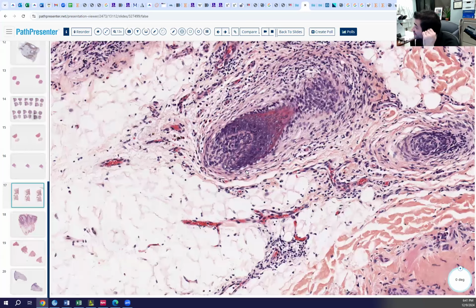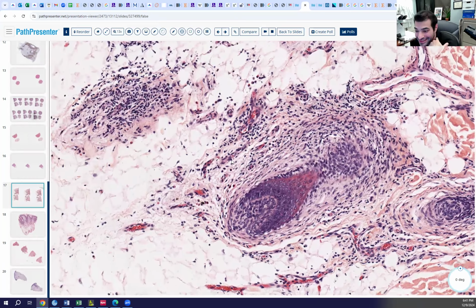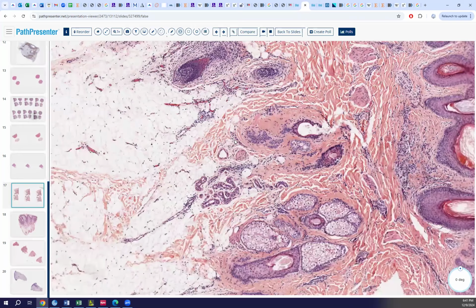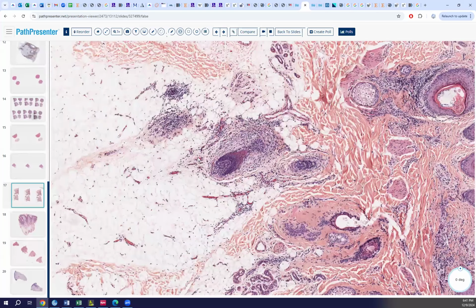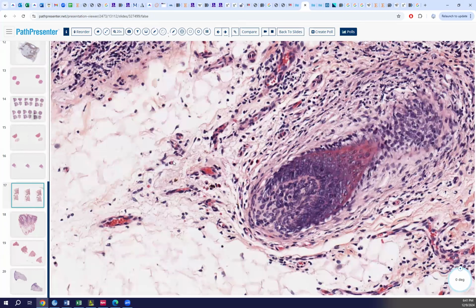What does that mean? What do we have to be worried about? Looks like alopecia areata, but the swarm of bees have plasma cells. What could also look like alopecia areata clinically?